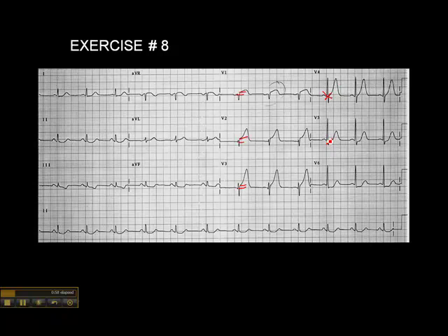There's no ST elevation in V5 and no ST elevation in V6 — just a little bit of ST depression. Technically, the criteria for an anterior wall MI is ST elevation in V3 and V4. Because we don't see it in V4, we can't say this is an anterior wall MI. All we can say is that this is a septal MI.